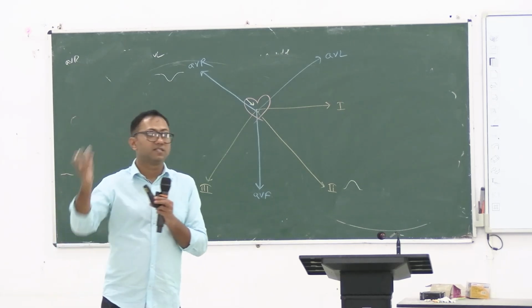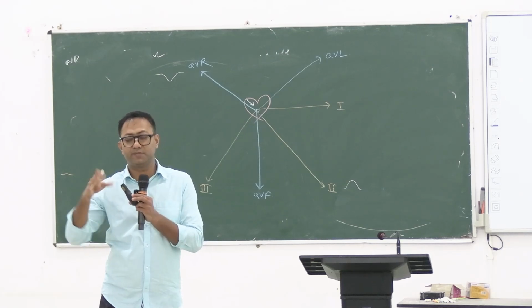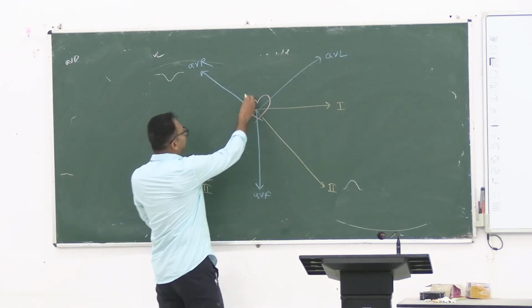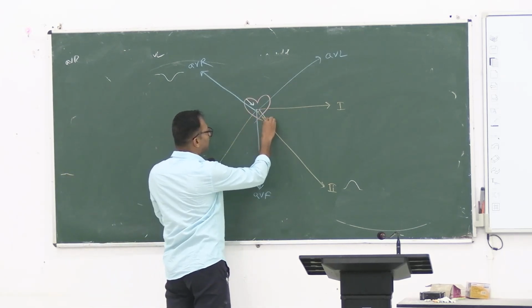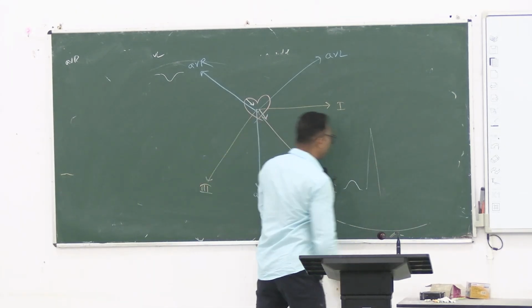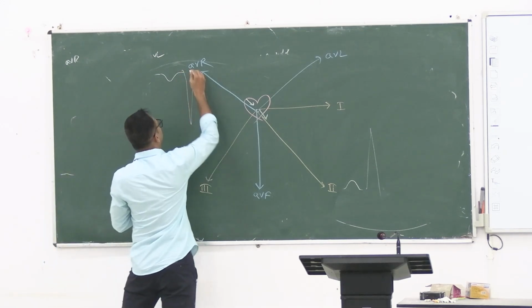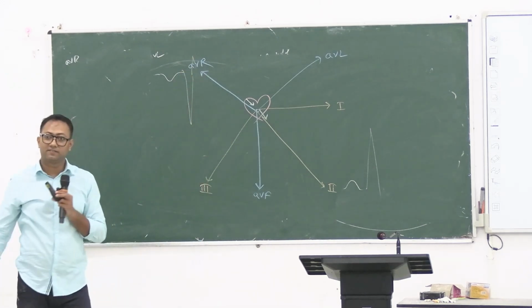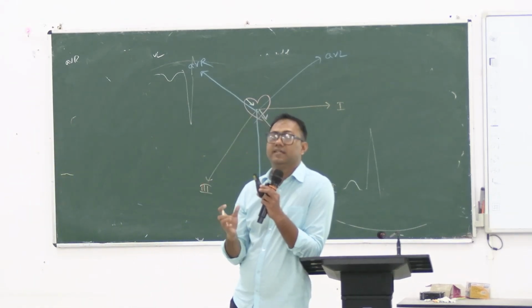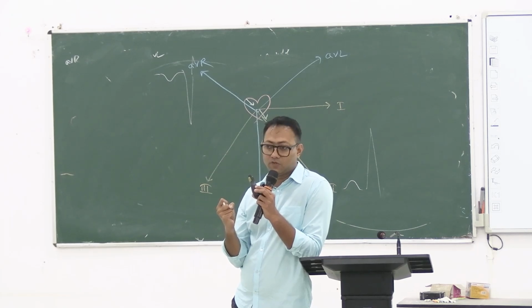So depending on that, similarly, the apical vector, which is the strong vector, which depolarizes the cardiac apex, इसका direction भी more or less towards the atrial depolarization vector, right? Again, you will get a strong R wave here in lead 2, and it will be negative here, S wave. Clear? So, depending on the vector's component, ECG leads show the deflection. Okay.